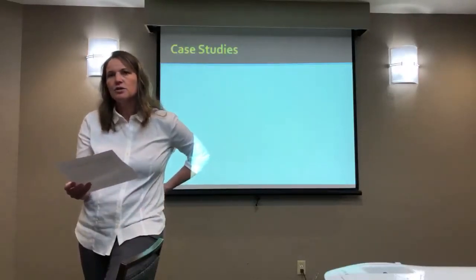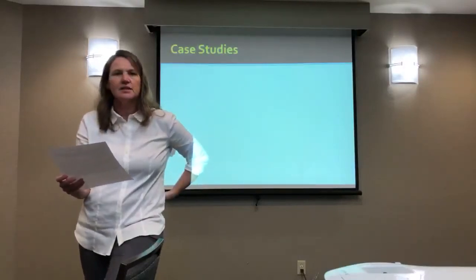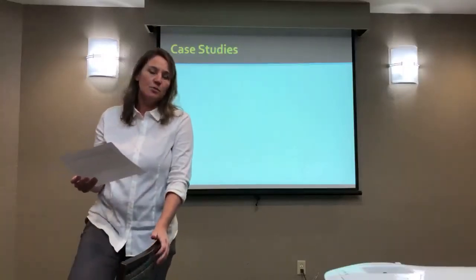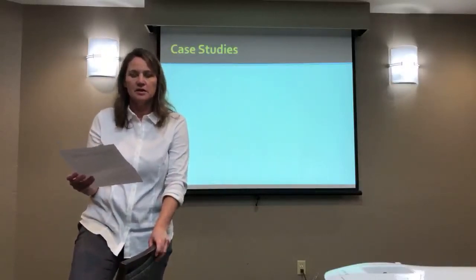What about duty cycle? We said 20%, sorry. And intensity. 0.5. Yeah, so most of the research used 0.5 watts per centimeter squared. That's absolutely fine to mimic that.